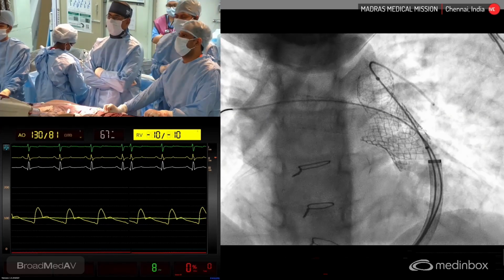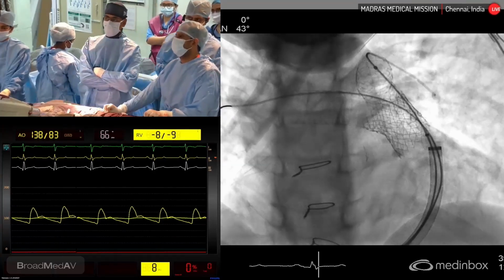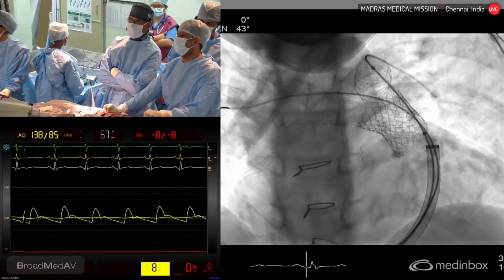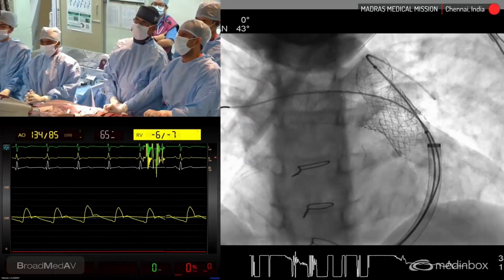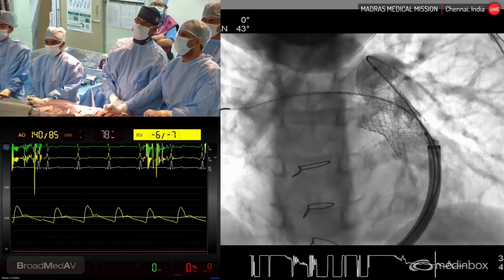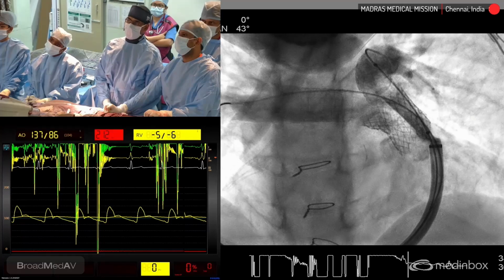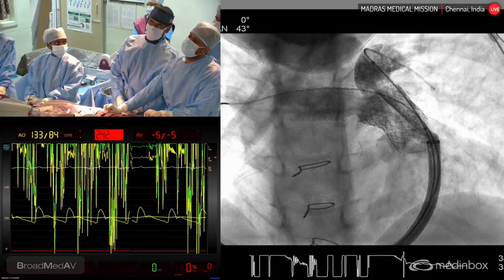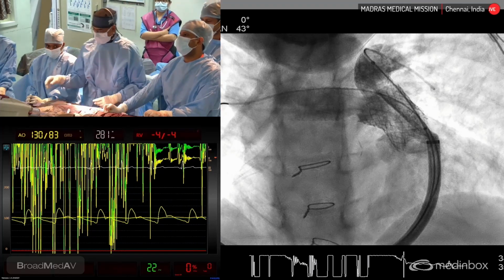I'll now take only a cine. So it's a 2 centimeter long stent. So possible that there is about 2 or 3 millimeters of the right pulmonary artery origin which is still uncovered. However, show the previous picture. Yeah, freeze it. When the dye is fully there, freeze it. Yeah, go back. Correct. So this picture now looks quite adequate.